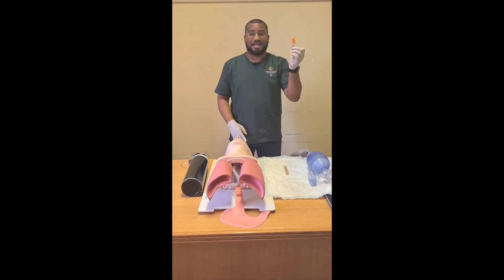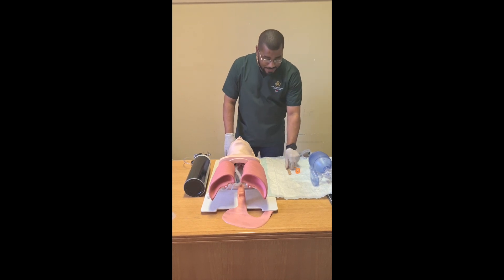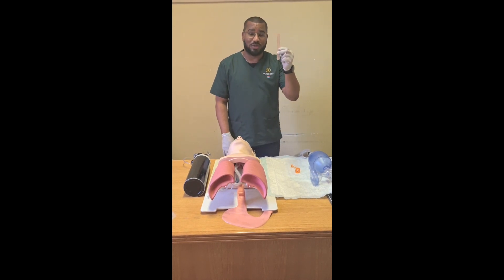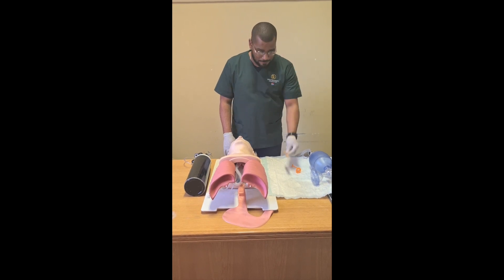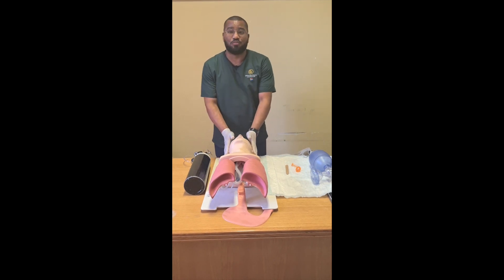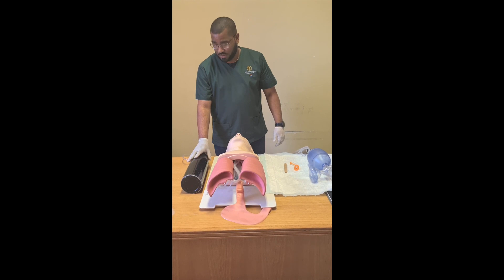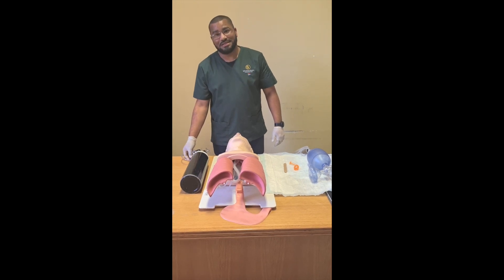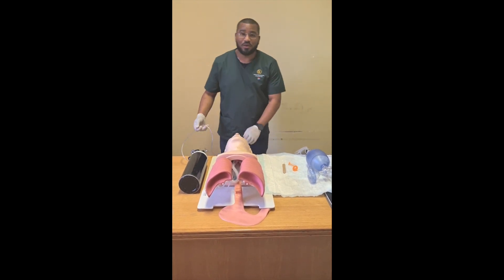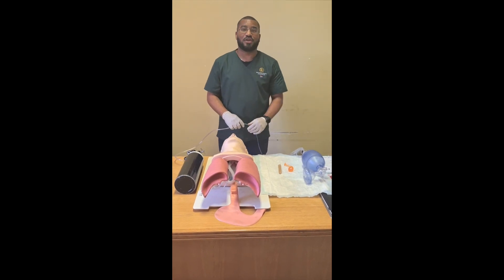An oropharyngeal airway, which is in short what we usually call an OPA. A tongue depressor, which we'll use in order to insert the OPA. A mannequin, which in this case is our patient, an oxygen cylinder that is full with a functional regulator, and an oxygen tubing which basically supplies the BVM with oxygen.